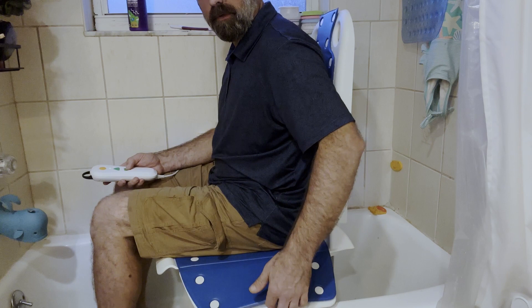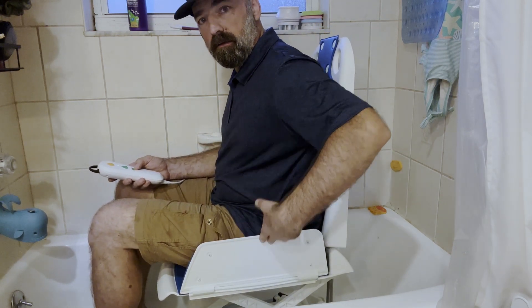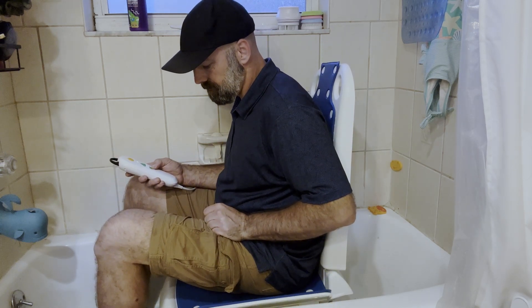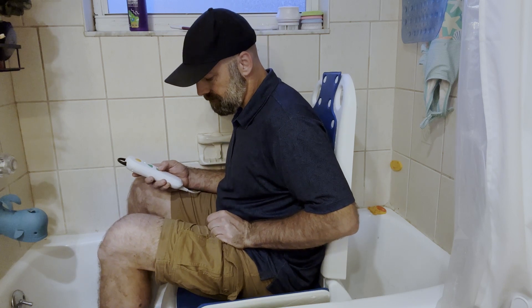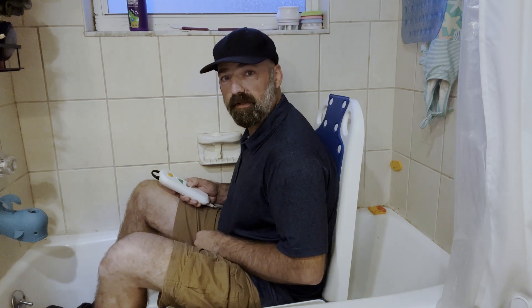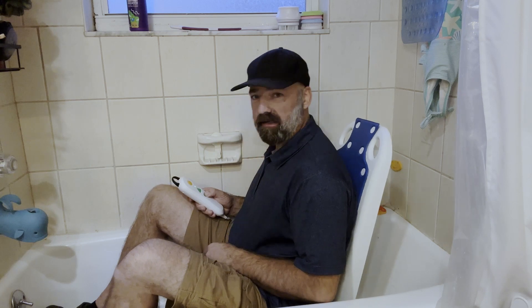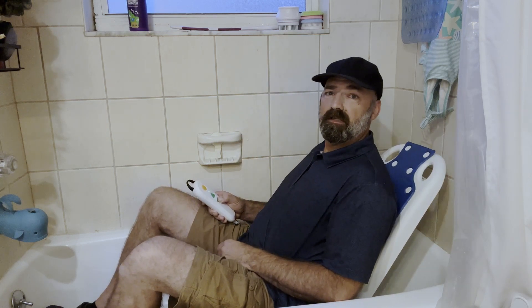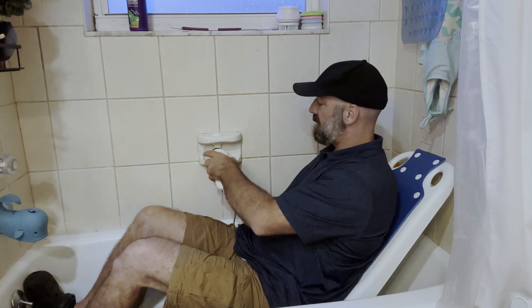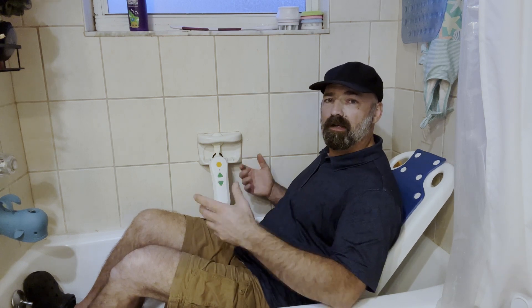You can see the little flap right here — it's going to start coming up and cuddle around my side. Now that we've hit the bottom, you can see it's actually reclining me back. Now I can sit in the water and put my controller back up. The controller is fully waterproof, so if it falls in the water, it's not a big deal.